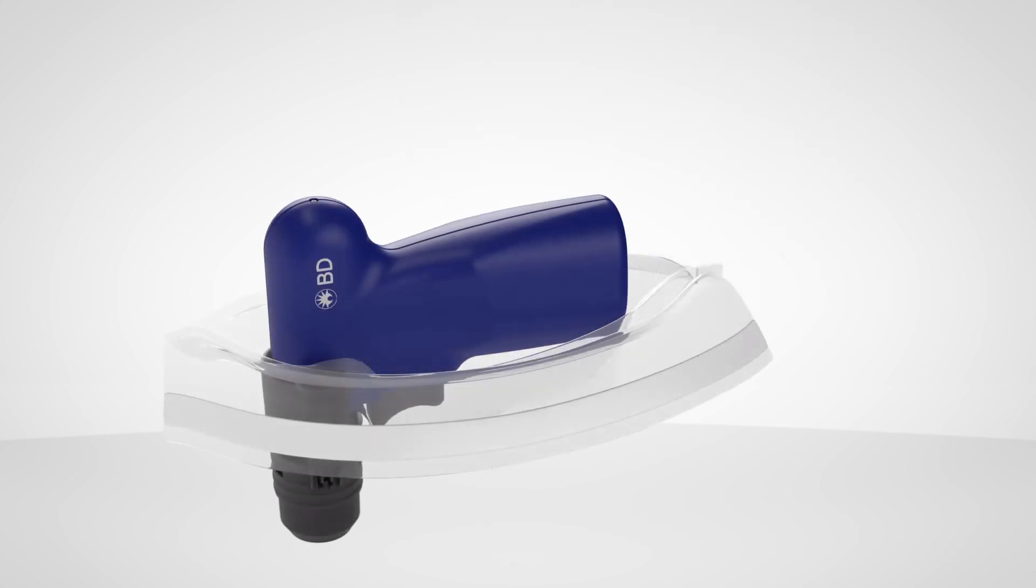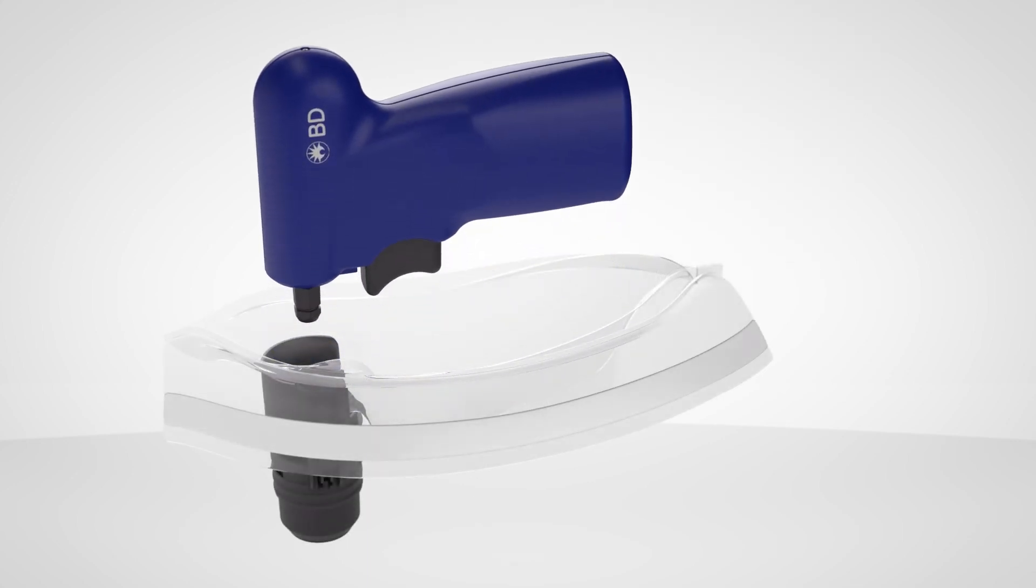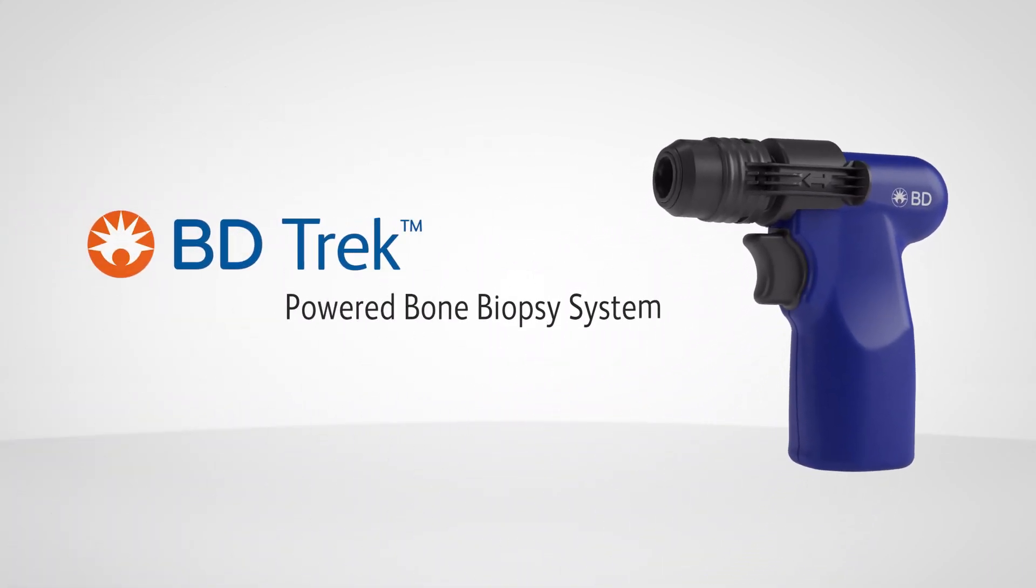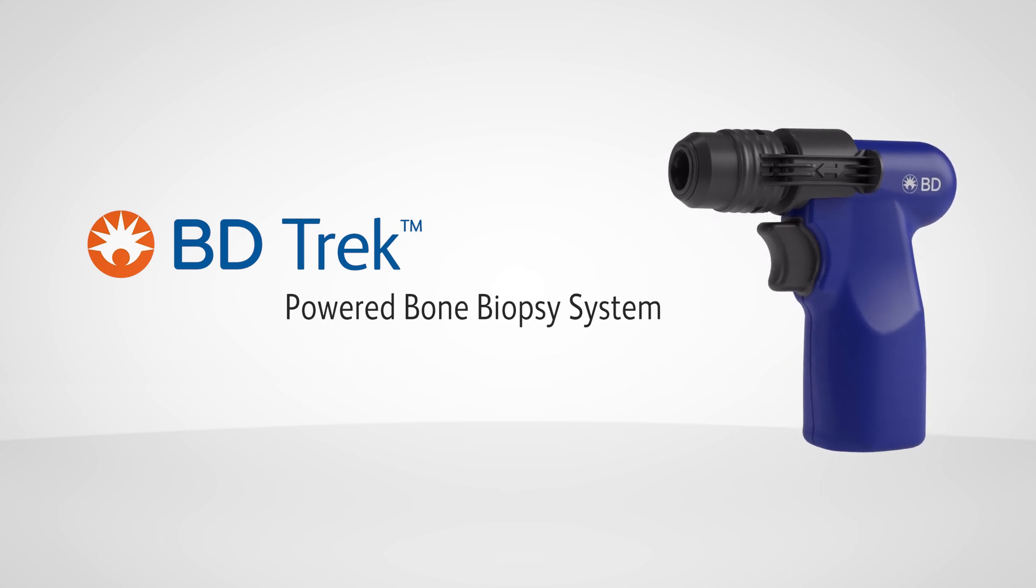And remove the power driver from the sterile sleeve. The BD-TREK powered bone biopsy system, the latest advancement from BD for bone biopsies.